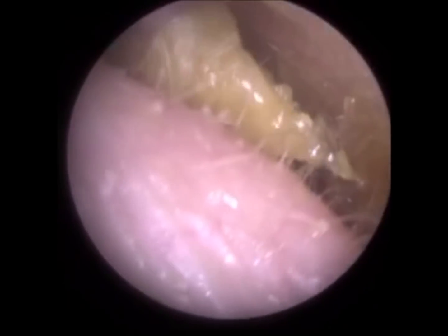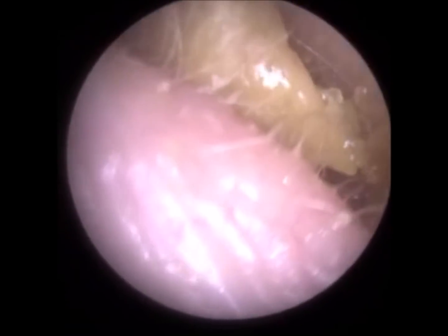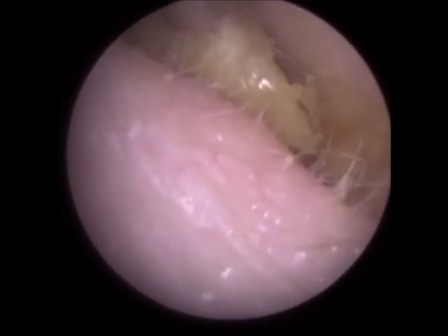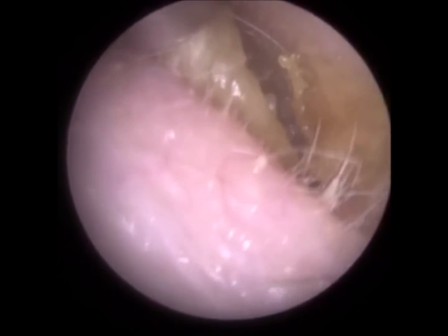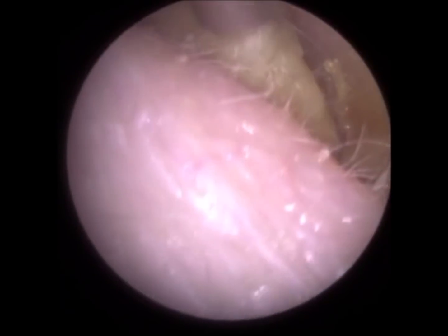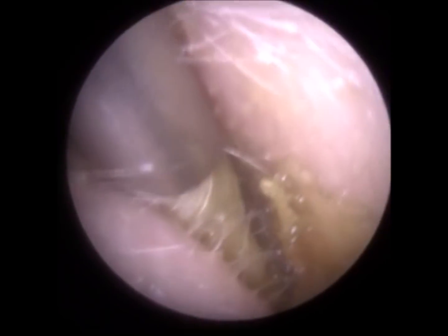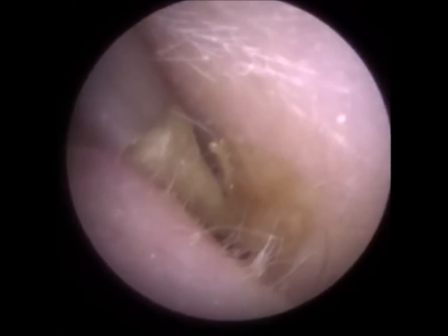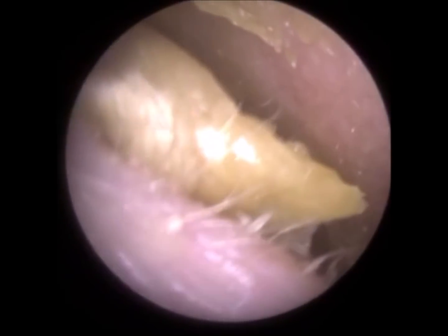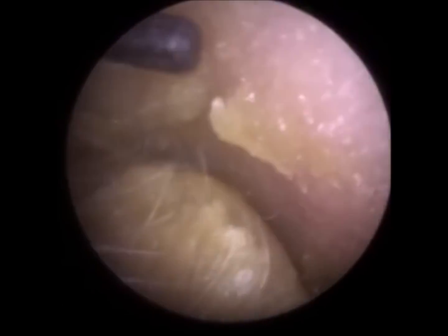So at a stage where you feel as though suction isn't good enough, or an ear hook isn't good enough, or forceps isn't good enough, as a viewer you'll realise it's actually better at that particular stage of the procedure, and vice versa. When people watch the videos, you see what's going on, and you may believe a particular instrument is better for that particular stage, but watching the video and actually performing the procedure is different. I can understand why people assume that, but when you're in the ear, you're getting the kinesthetic feel. You're feeling the texture of the skin and the wax, and it's not always evident when you're watching that.